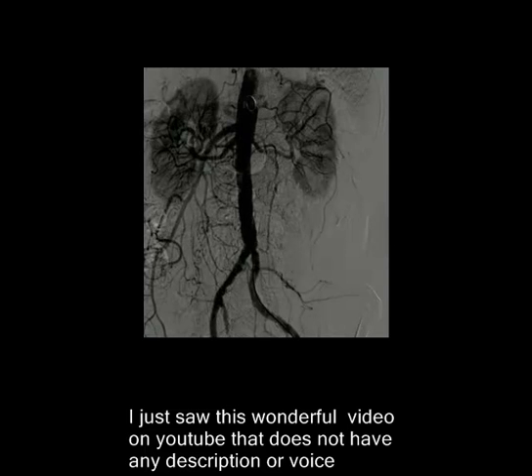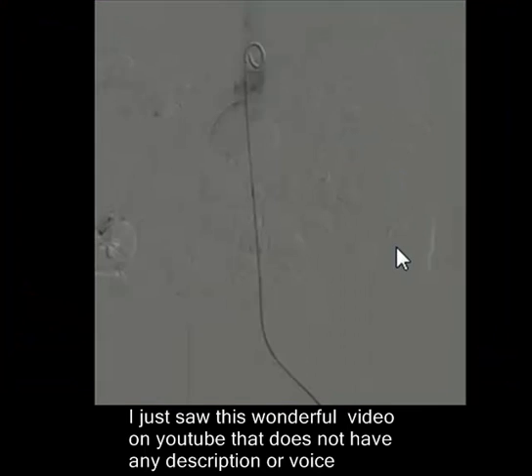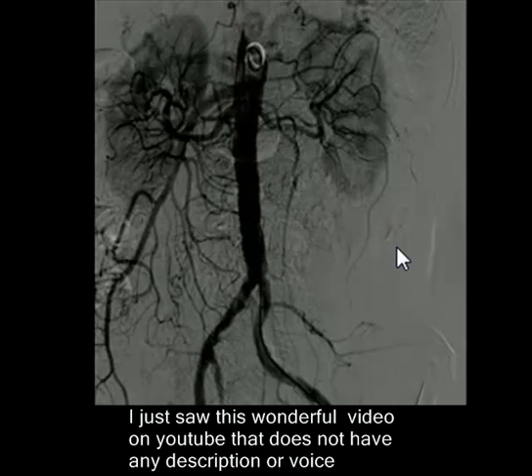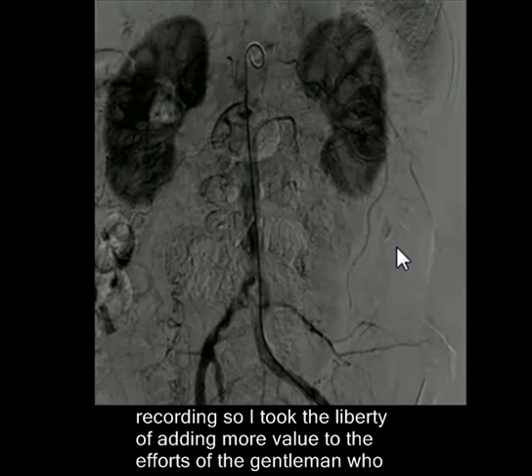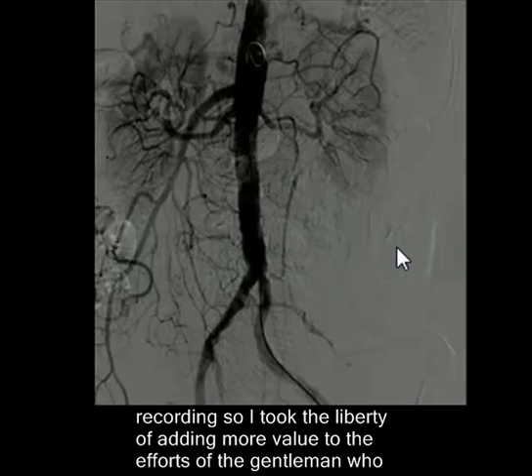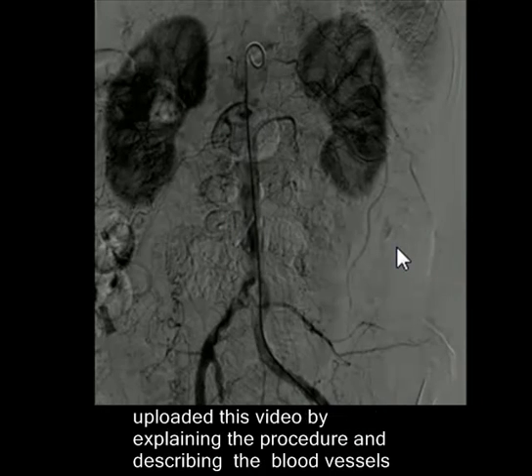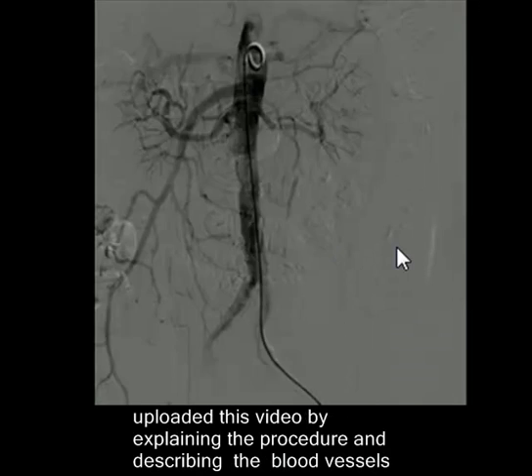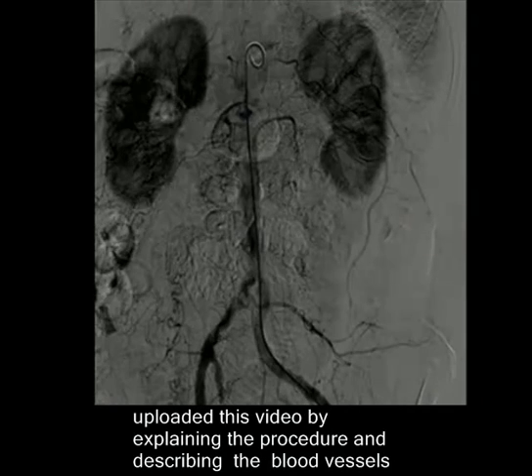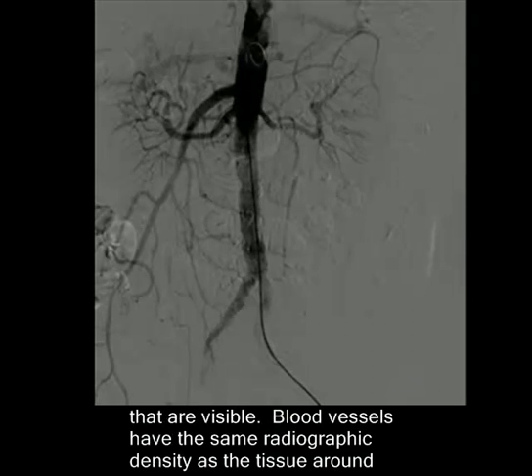I just saw this wonderful video on YouTube that does not have any description or voice recording, so I took the liberty of adding more value to the efforts of the gentleman who uploaded this video by explaining the procedure and describing the blood vessels that are visible.